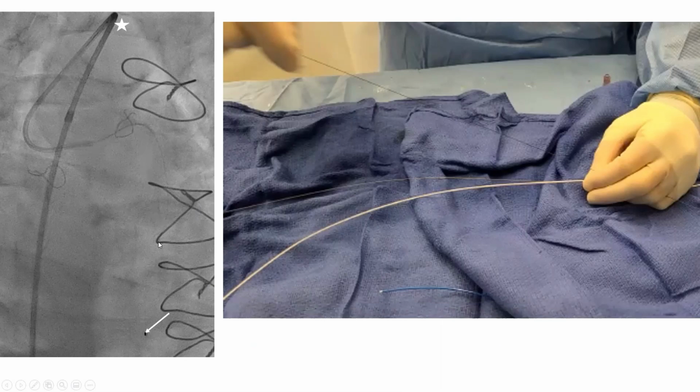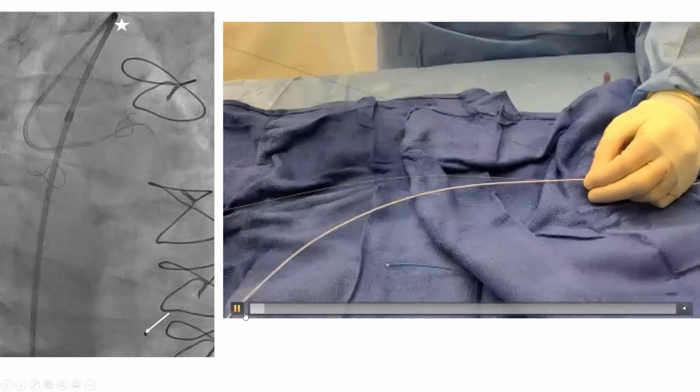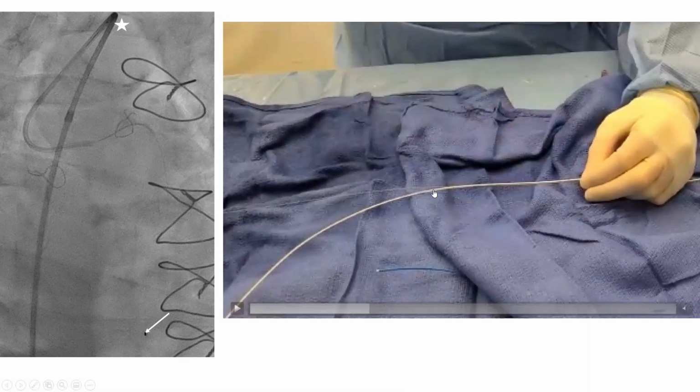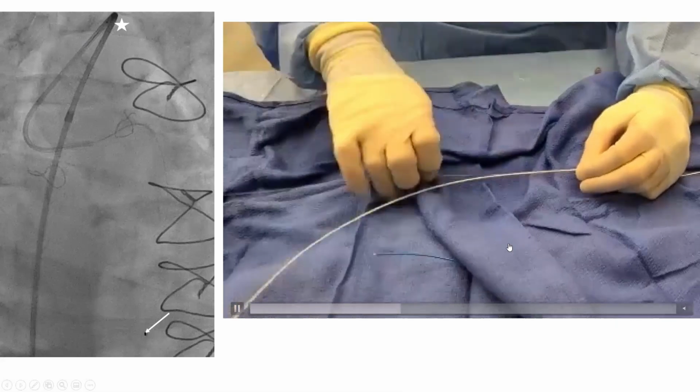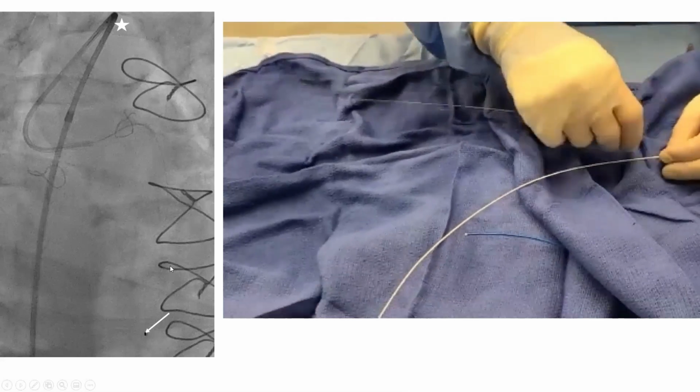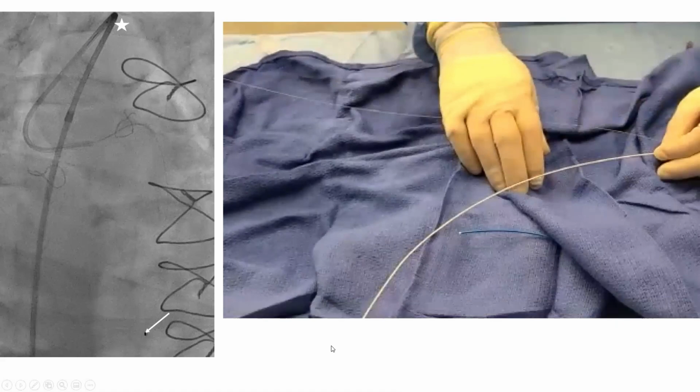You advance your catheter over the BMW wire all the way to the distal graft. And after you get the catheter tip to the distal graft over the BMW, then you pull the BMW wire, as you see here. Now, after you've pulled the BMW wire, for the first time, you spread apart the spider wire and the spider catheter, and now you're ready to advance that spider wire that is positioned way back. You're ready to advance it through its own monorail inside the catheter all the way into the distal graft. So see here how we're spreading apart now catheter and wire, and now we're advancing the spider wire in a monorail fashion all the way till it reaches the distal graft.